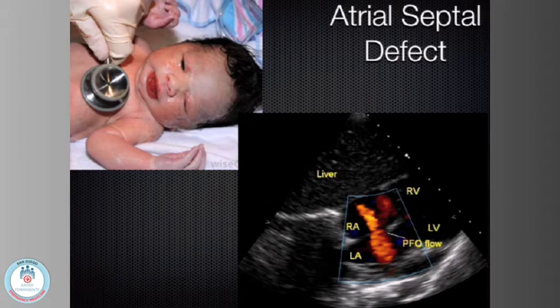Normally you wouldn't look at valvular flow here because you're too perpendicular, right? But if you had a newborn come in who wasn't oxygenating well and looked really cyanotic, you start worrying about an atrial septal defect.